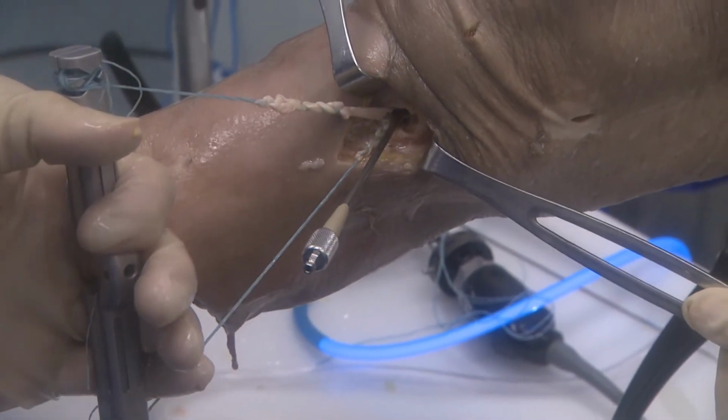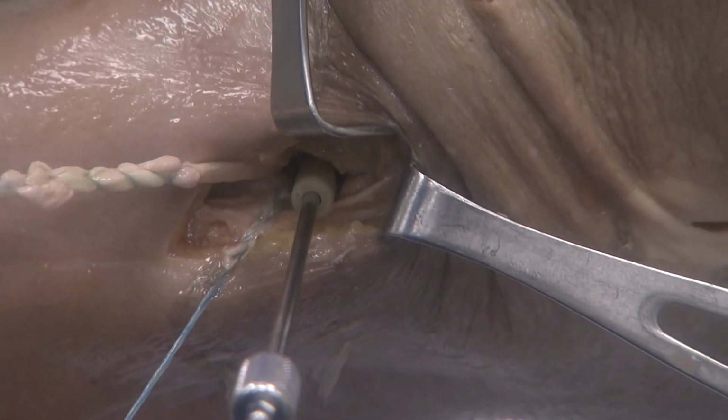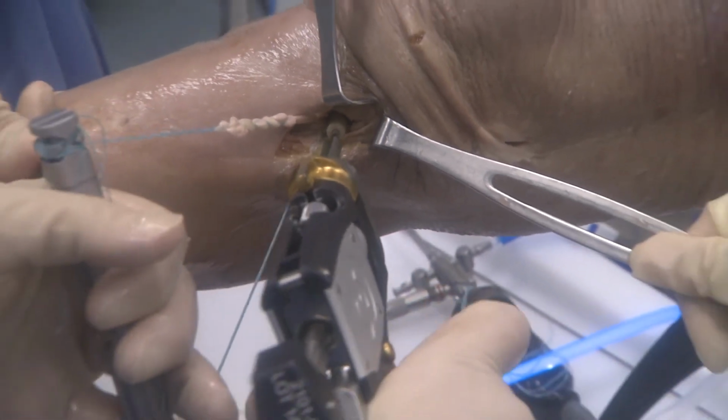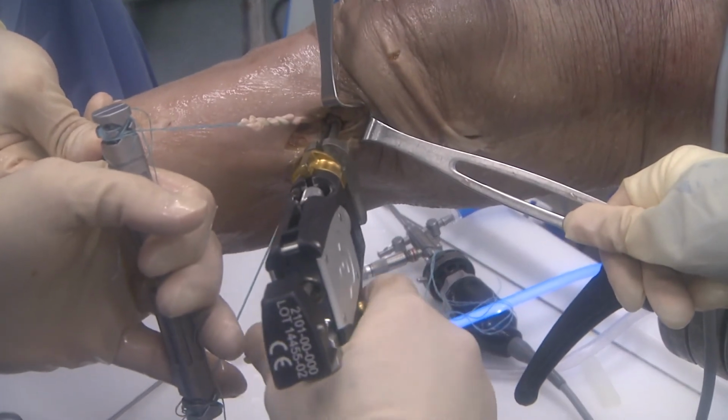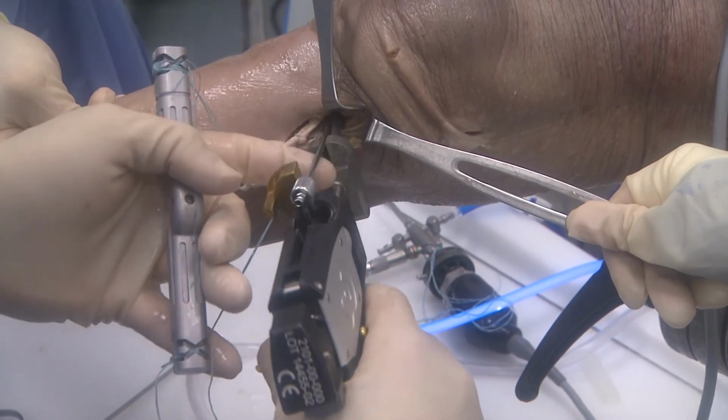The implant stays in place. I keep tension on the graft. I slide the bullet down. The bullet is going to be deployed into the sheath. Put this on the back side of my gun and lock it down. And I squeeze the trigger to deploy the bullet into the sheath. Then I remove the gun.